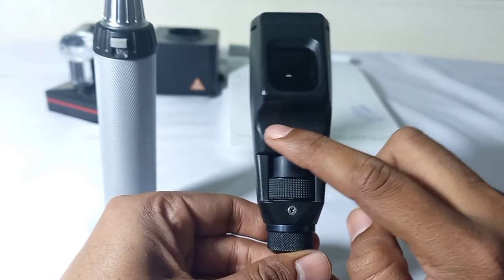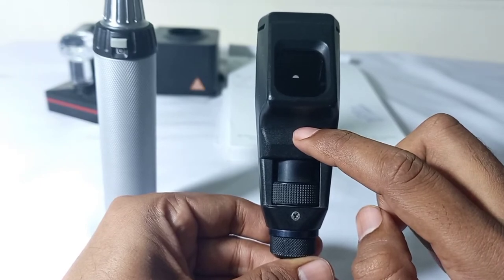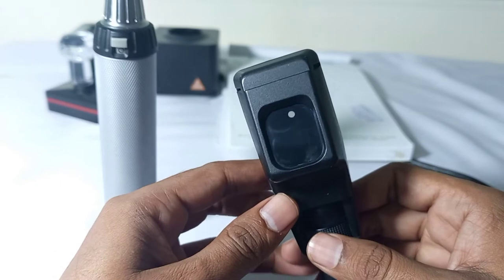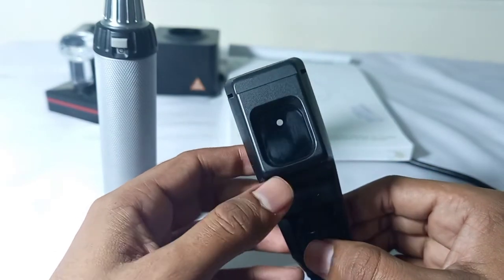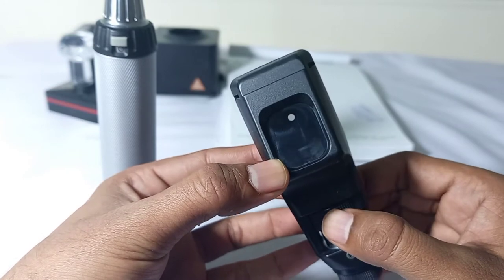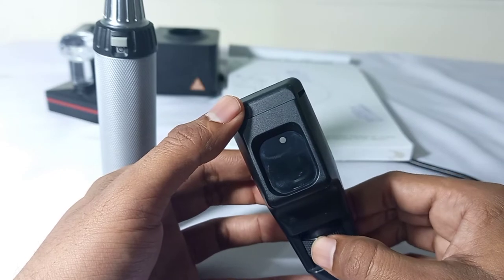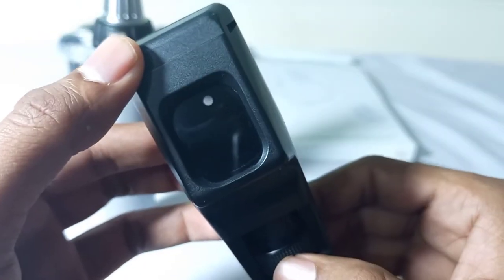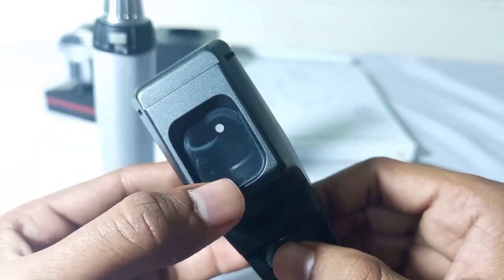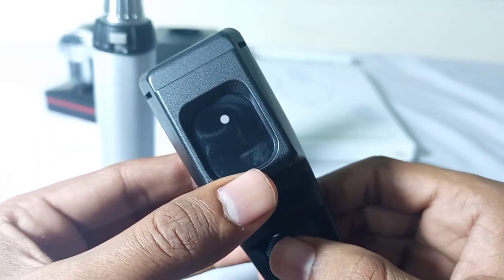Above the sleeve of the retinoscope, you can see inside the retinoscope there is a condensing lens, which cannot come out on its own. When I move the sleeve up, you can see the condensing lens coming out. So the condensing lens inside the retinoscope is movable.